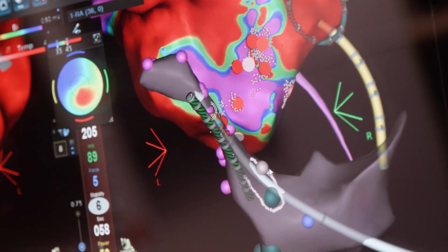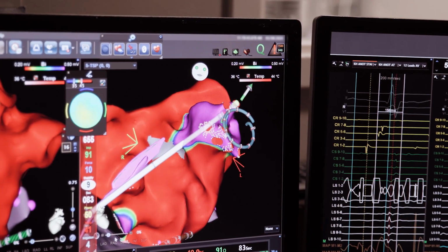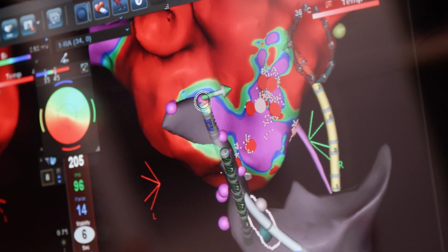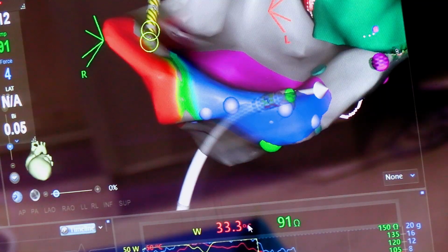Well, obviously, the biggest benefit of all the technology that we went through over the years is the integration with the three-dimensional mapping system, which has become critical together with intracardiac echo to make the procedure fluoroless or with less fluoro, because we can use the three-dimensional mapping system to create a geometry and deliver lesions on the geometry without using fluoro all the time. So it clearly has been an important component of the evolution of catheter ablation because it gives us a geometry where we catalog all the information that is relevant.